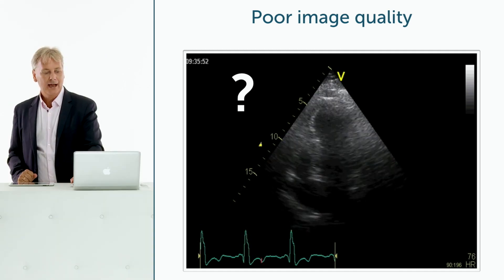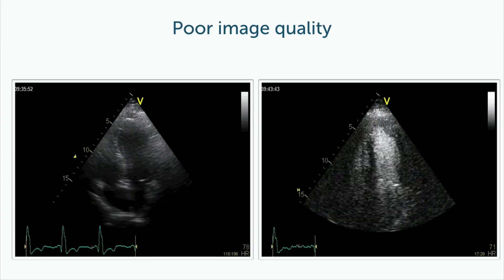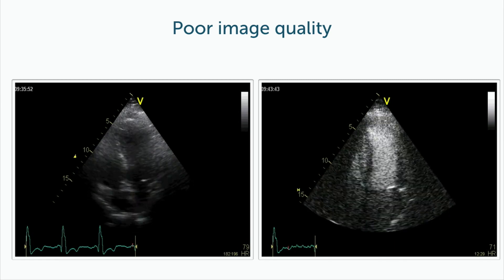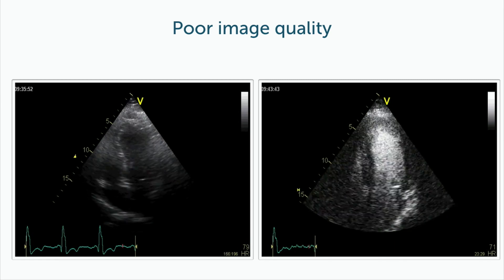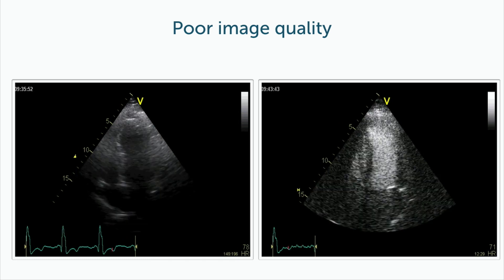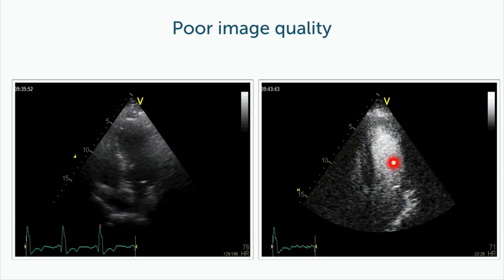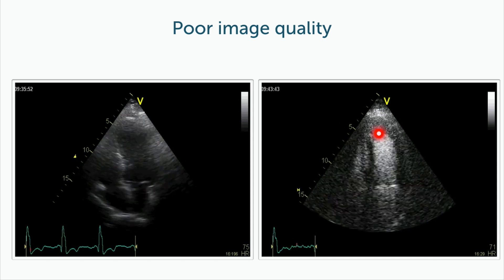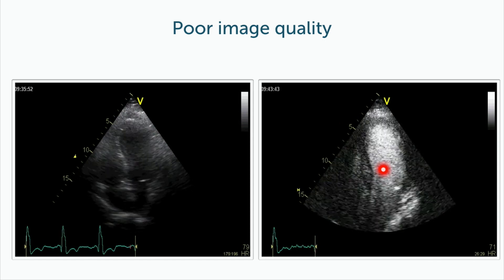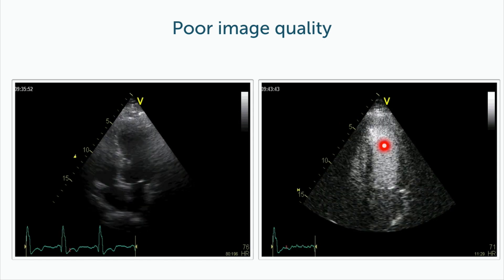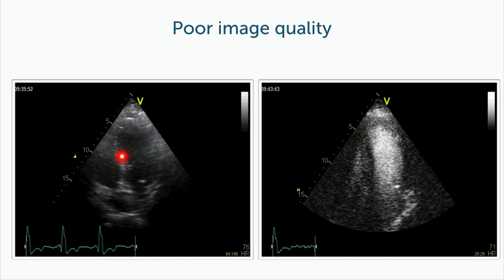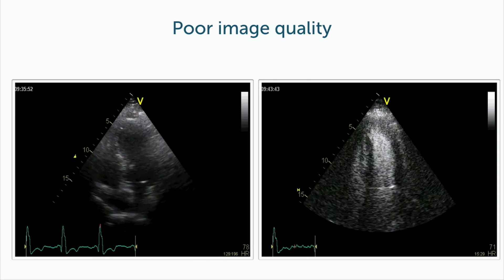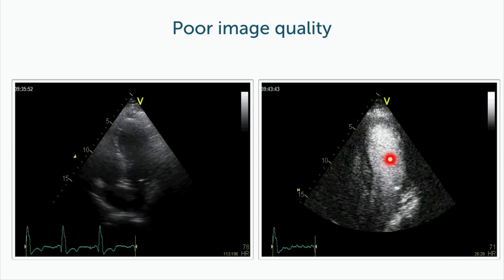Take a look at what happens when we really use contrast here. This is a spectacular difference between the conventional image and the contrast study. Look how nicely you can all of a sudden see the contour, the size of the ventricle, and also assess the function. So while you might believe the patient has poor left ventricle function on the conventional image, everything is quite clear in the contrast study.